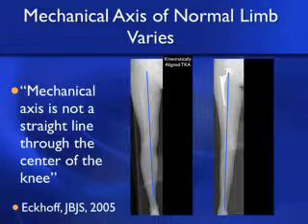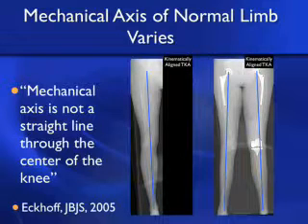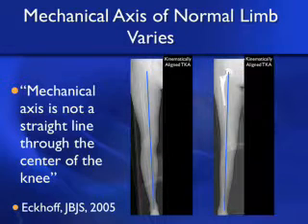Here's another normal-looking knee, but it's valgus. This is the way this patient's been their whole life. And indeed, here's the kinematically aligned knee, which produces the limb alignment back to that which she's had for many years. And the degeneration in the left knee was caused by trauma, and the right knee does not have these changes at all.